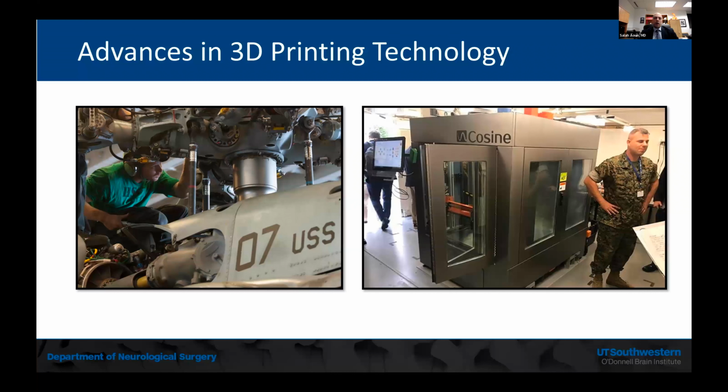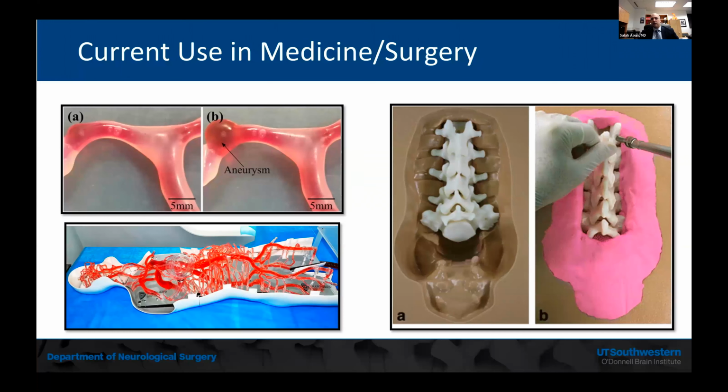Same for the spine model, where the spine, I think it's designed by Emery, was buried in sand to allow residents to work on putting pedicle screws. The application and learning from these models is limited because it's a static model that allows you to extrapolate what you're going to do to everyone else through them, but it's fairly limited.